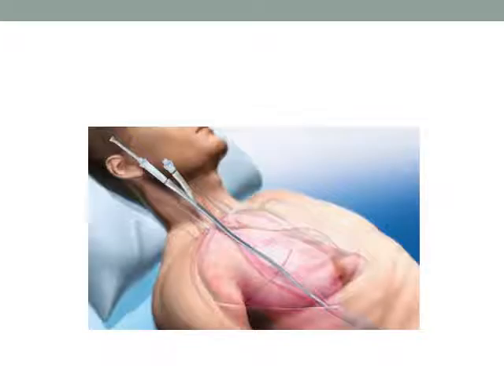Okay, so huge. Yes? Do you ever see tricuspid issues long term after the cannula's been sitting in there for a while? So the cannula actually doesn't cross the tricuspid valve. Now, it does have a jet that aims at the tricuspid valve, and we have never recognized important tricuspid abnormalities from that.